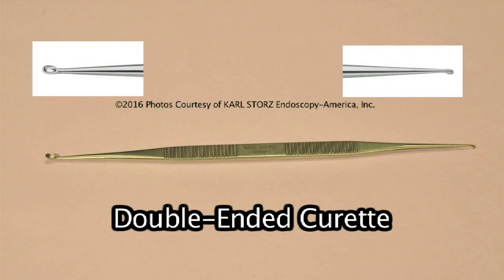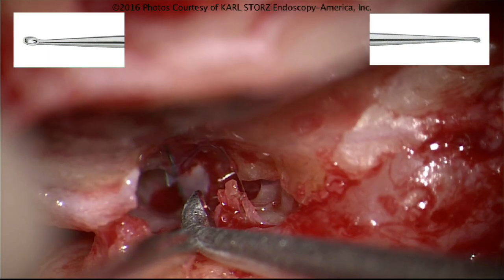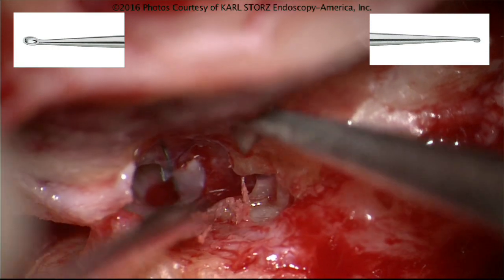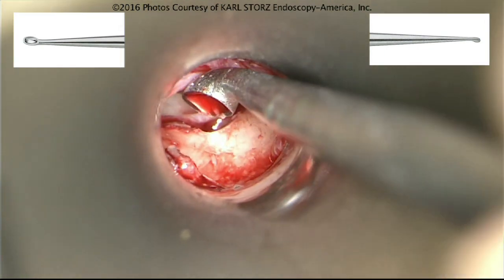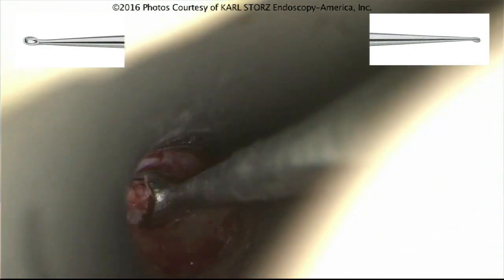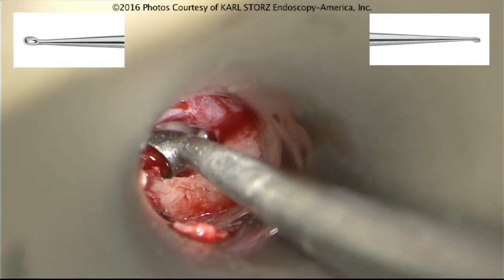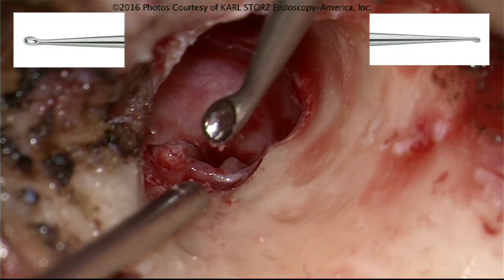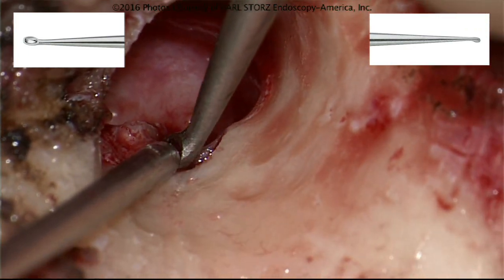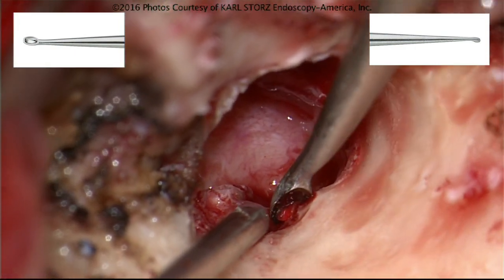The curette has a number of valuable uses including removing bone of the ear canal. It can be used for dissection of disease out of the mastoid air cells, and for removal of the final sheets of bone in a surfer's ear or exostosis surgery, when the drill has taken bone down to the tympanic membrane and the last shelves are removed without injury to the ossicular chain. An important technique is to use the curette as a fulcrum, resting it against the speculum in a twisting, fulcrum motion to get more power.